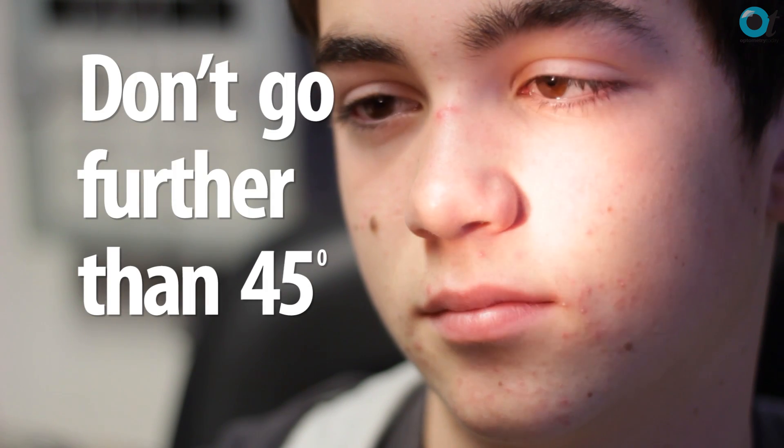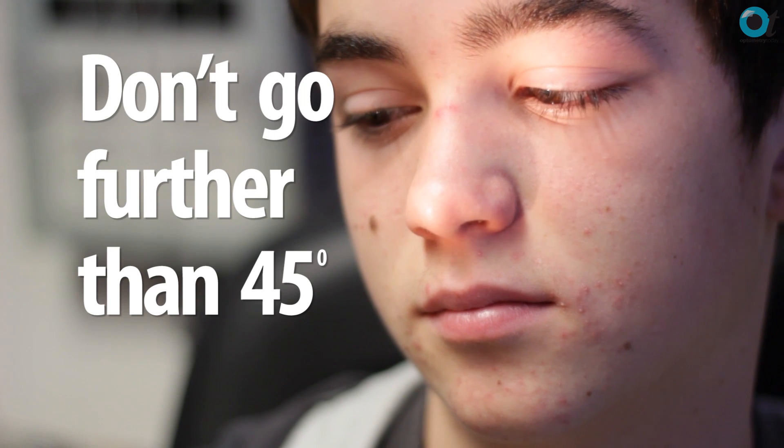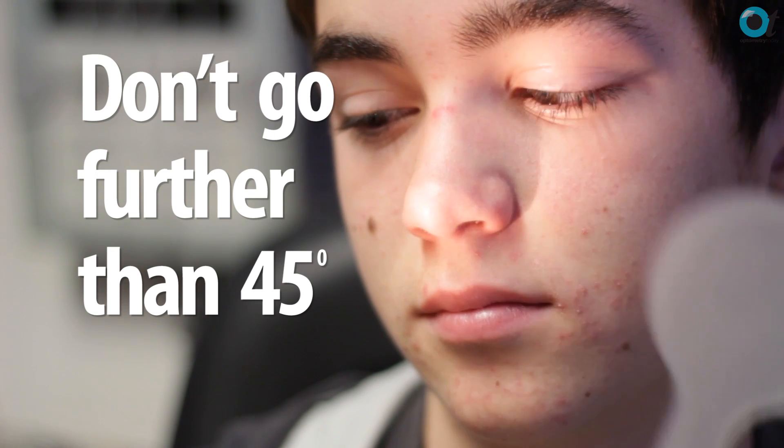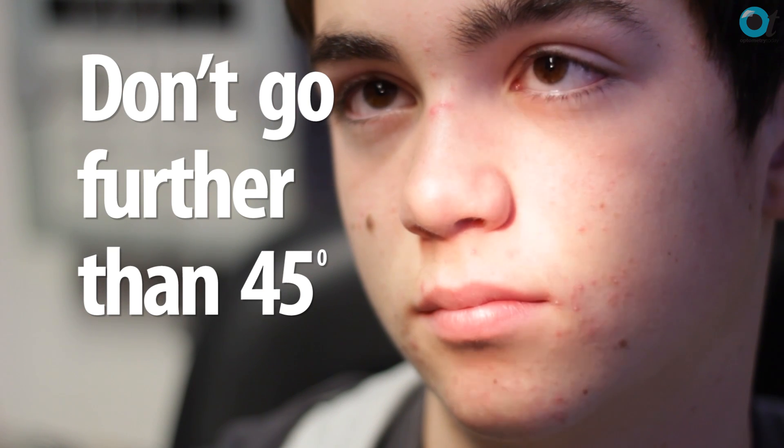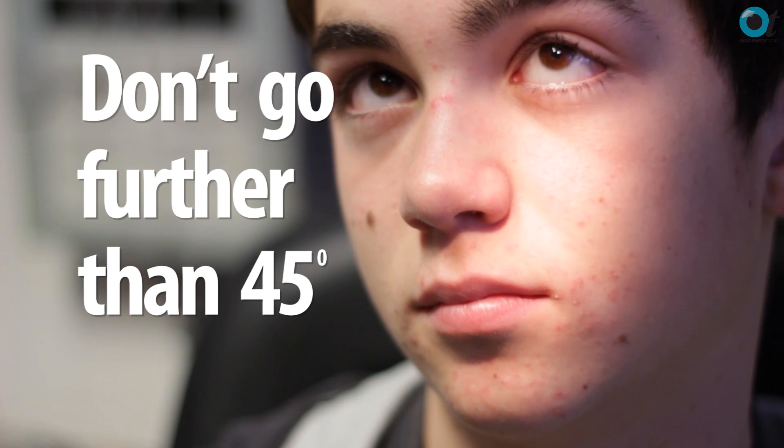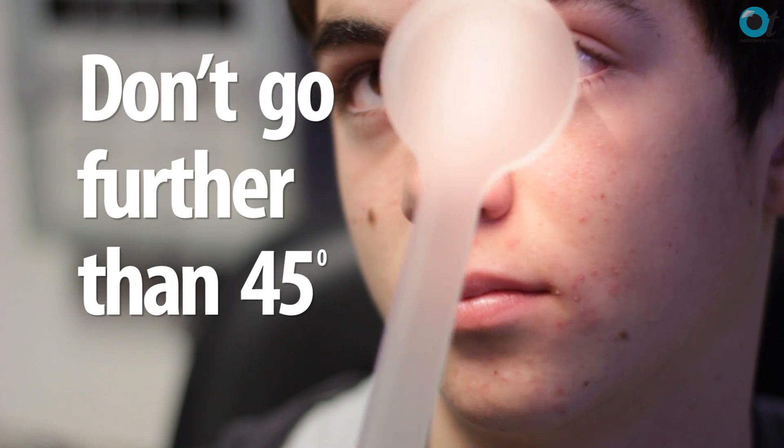Since we know that the extraocular muscles join on — the superior rectus at about 23 degrees — you don't need to go much more than 23 degrees from primary position to test the superior or inferior rectus. The obliques require a little more, but you don't really need to go beyond about 45 or 50 degrees to test their effectivity. Try very hard not to go any further out than that whilst doing motilities.